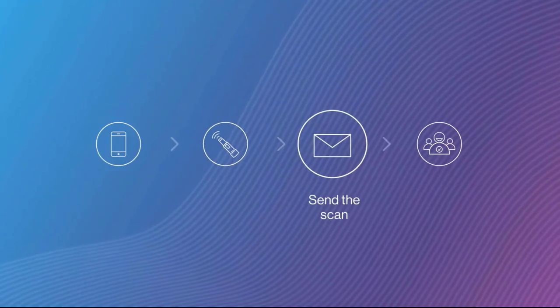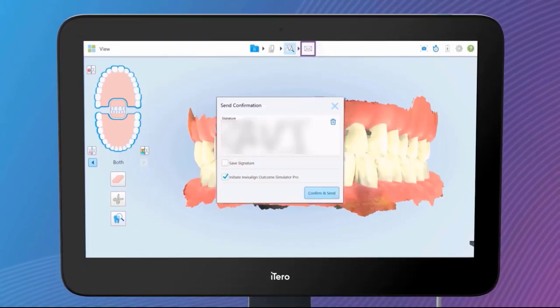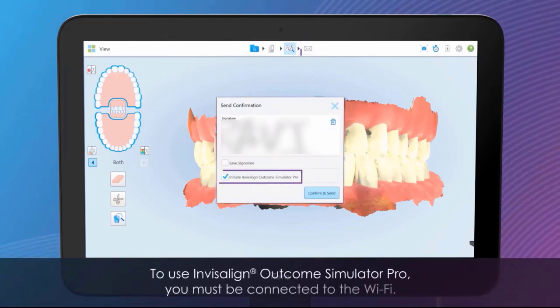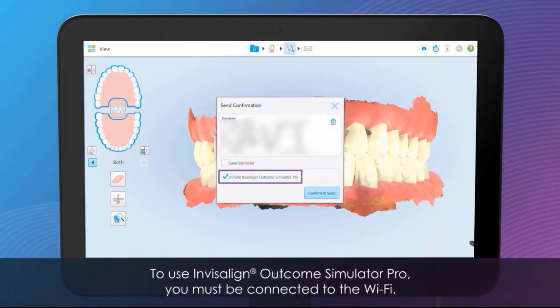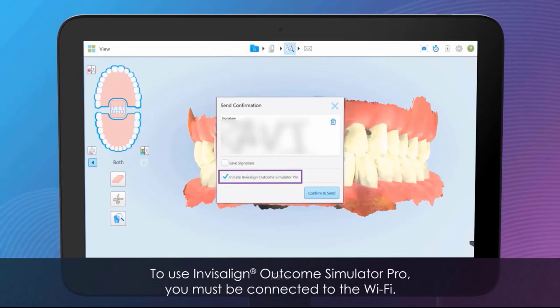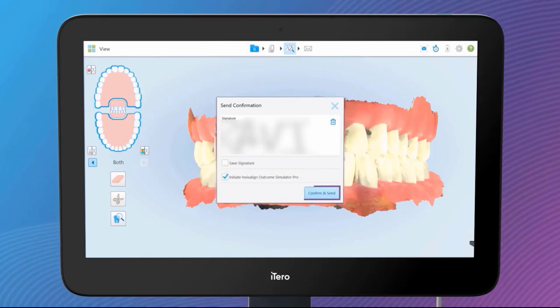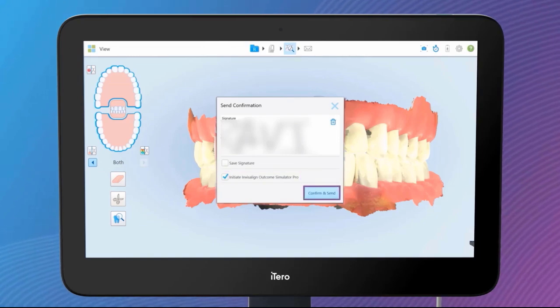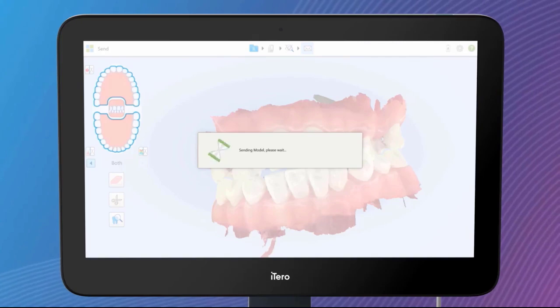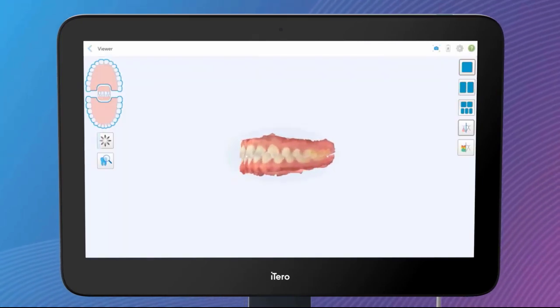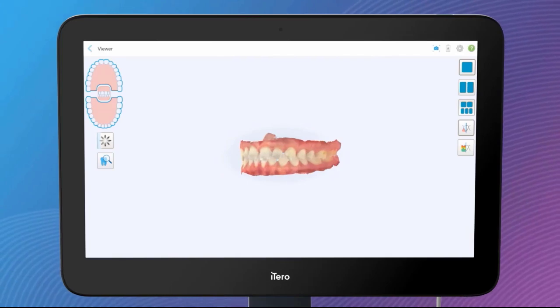The third step is to send the scan. Tap the Envelope button and send the scan. There's a new checkbox for Invisalign Outcome Simulator Pro — this checkbox will automatically initiate the simulation for the current scan. Tap the Confirm and Send button. The scan is being uploaded to the cloud and the simulation is being generated in the background.